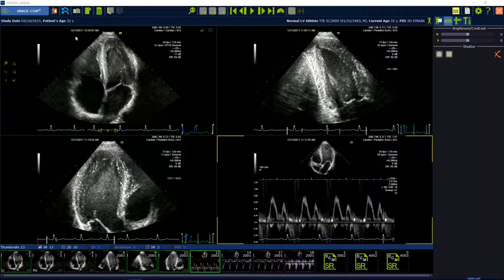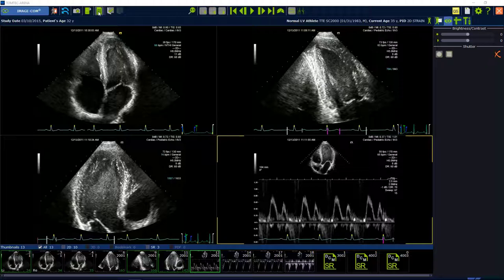The toolbar of Image.com offers four different export options: secondary capture, export images and clips, export measurements, and the PDF quick print.